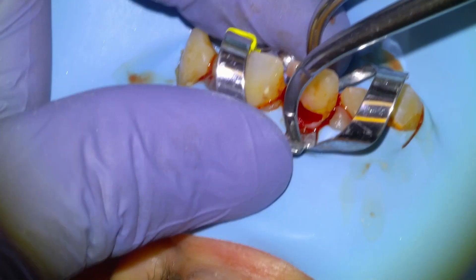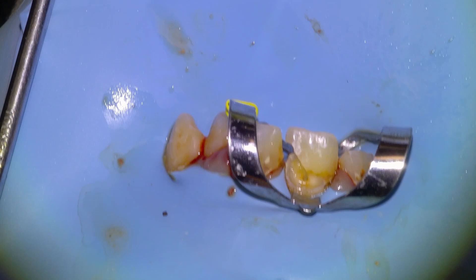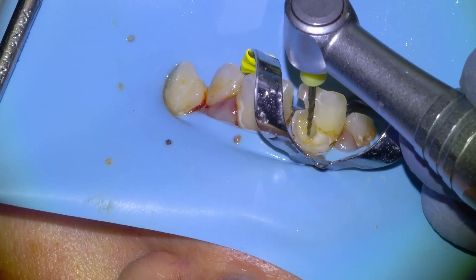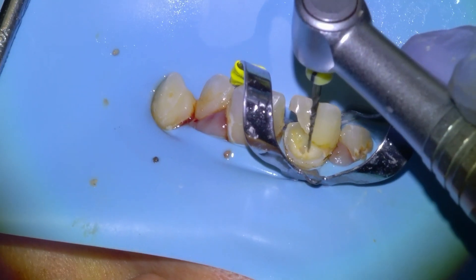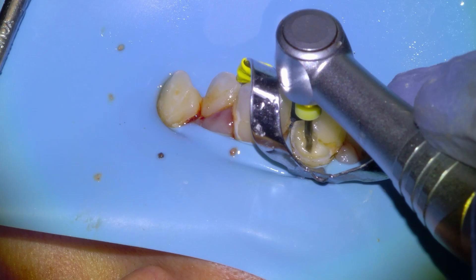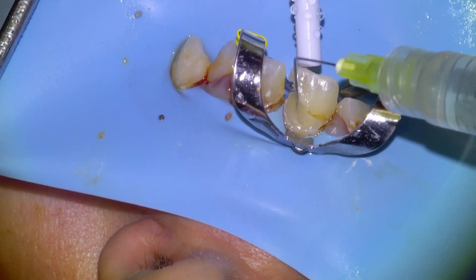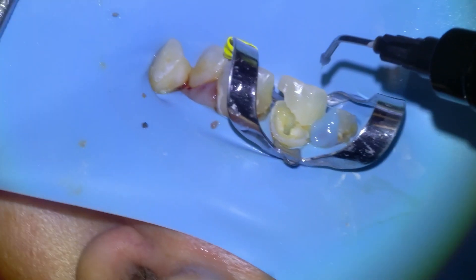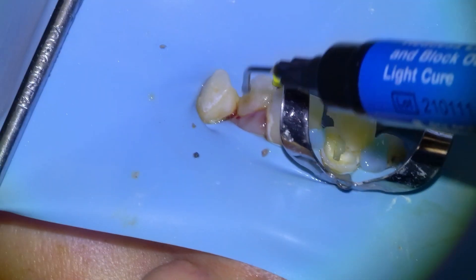When we do a root canal we're using a pretty caustic sterilizing irrigant that's basically just household bleach, also called sodium hypochlorite, so we need to make sure we have a clean field that doesn't leak into the patient's mouth. Root canal is basically done by using rotary files and opening up the nerve chamber — where the nerve and blood vessels would have lived if this was a vital tooth. Once a cavity gets into the nerve, the nerve and blood vessels die and devitalize, and then it's just a bacterial infection inside the tooth — basically an empty cavity with bacteria that will cause pressure buildup, and that's what an abscess is.